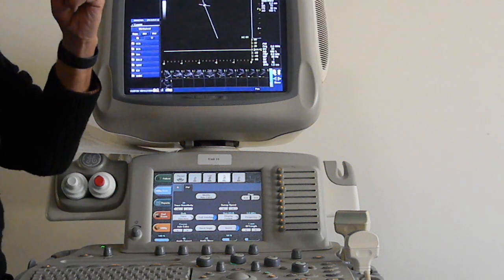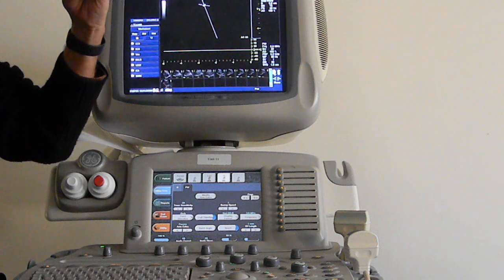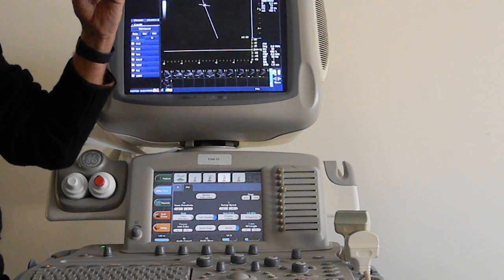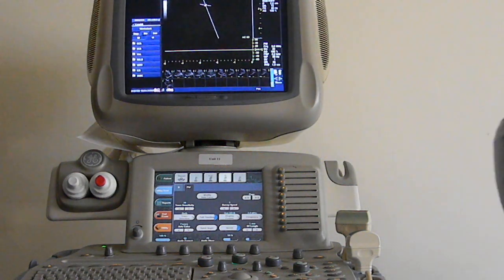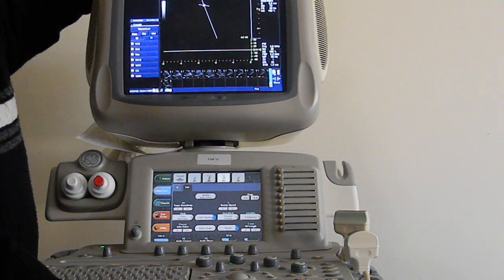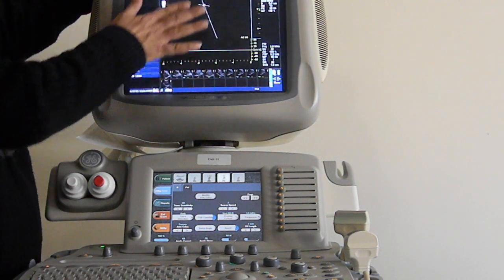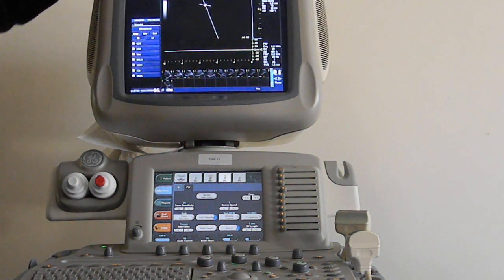60 centimeters is going to be something close to this. That's the distance that will be traveled by your blood cell in a second. And that's even low. This speed is still low. And so this happens to be a spectral Doppler, and this is going to be a pulse wave Doppler.